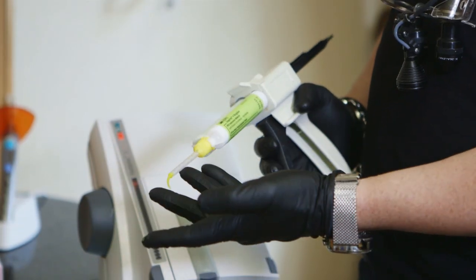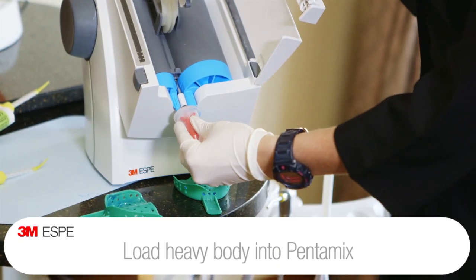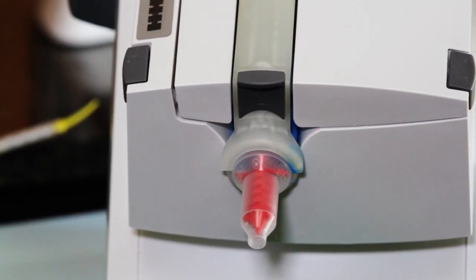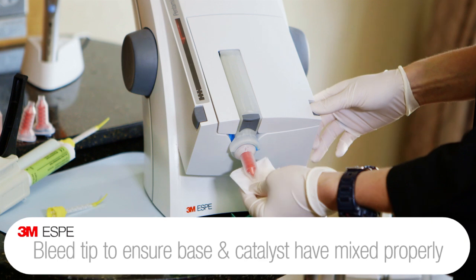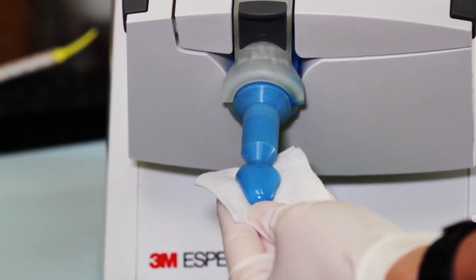I like to bleed a little bit out the tip here before I go into the patient's mouth. So we've loaded the heavy body in the machine, and now we're just gonna go ahead and load the tips onto the Pentamix. As soon as we turn it on, we like to bleed the initial tip here, just to make sure the base and catalyst have mixed adequately. And as you can see, we're ready to roll.